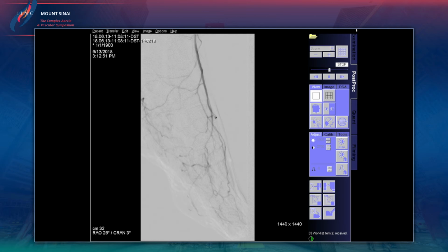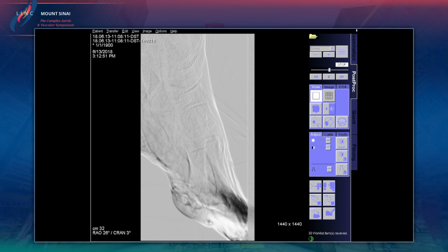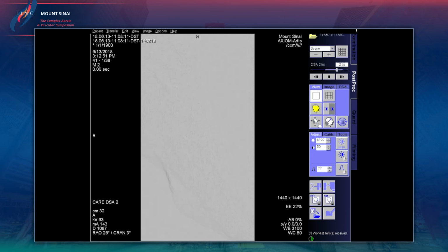Yeah, I think that's, yeah, there you go. You can see the lateral plantar. Much better. Look at that. That's much better. It's right at the base of the first metatarsal head. Sorry, sir, I know a little bit of movement. I apologize. So I think, over here, we're just going to stick with just atherectomy and balloon in order to be able to get this open.